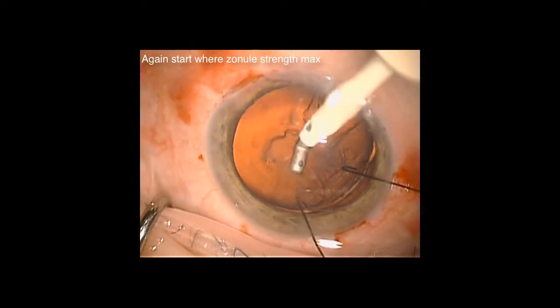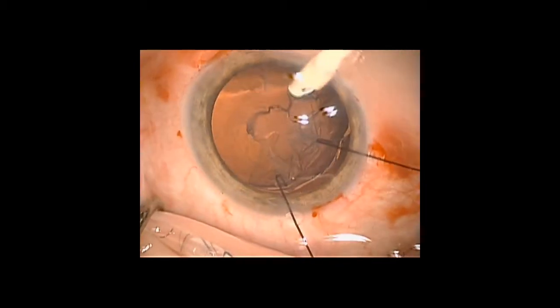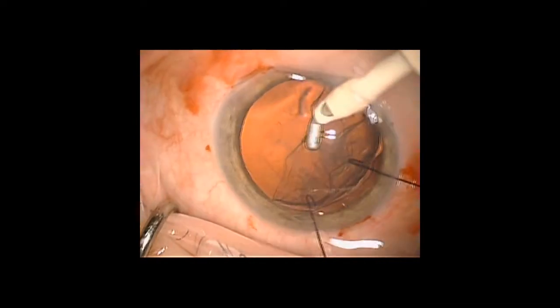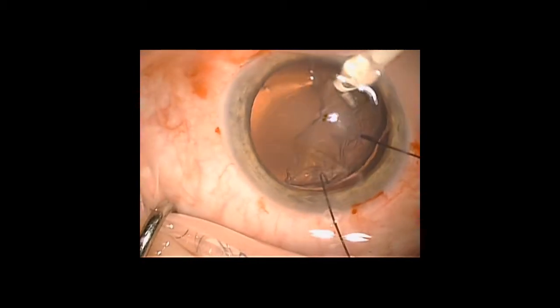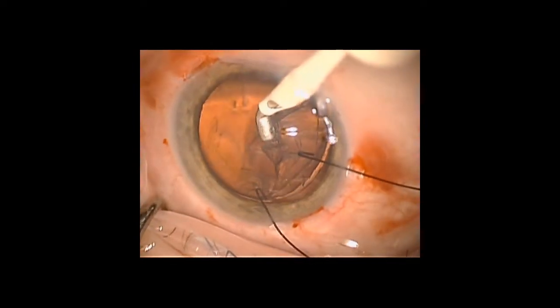Carrying out cortex removal, again start where the zonules are strong. Subsequently, only very gently assess what cortex can be safely removed from the area of zonular weakness here, supported only by the iris hooks, prior to implanting the capsular tension ring.